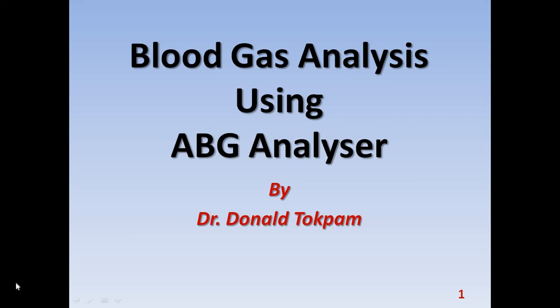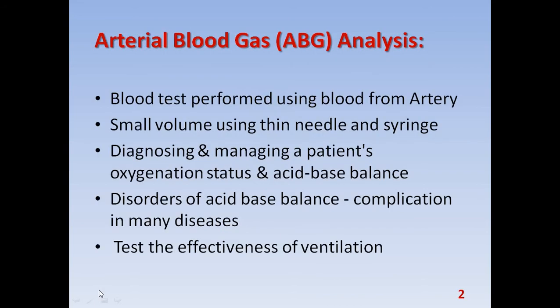Good morning, everyone. Today, our topic of discussion is blood gas analysis using ABG analyzer. ABG full form is arterial blood gas. Arterial blood gas analysis is a blood test performed by using blood from artery.